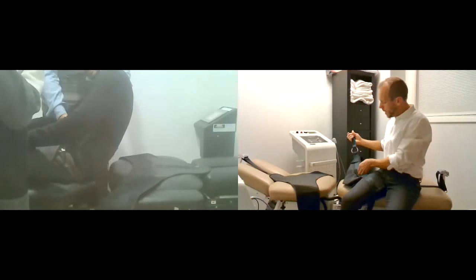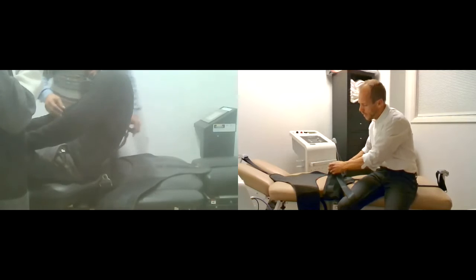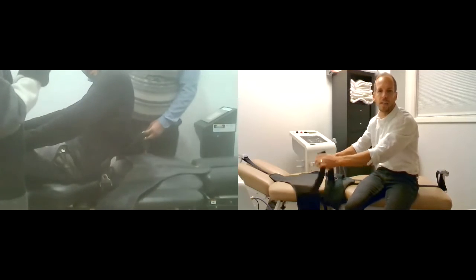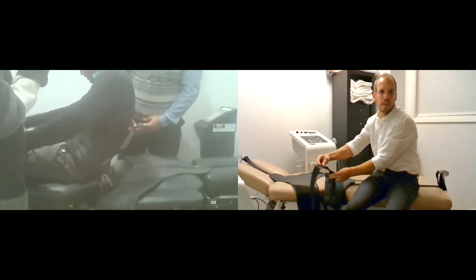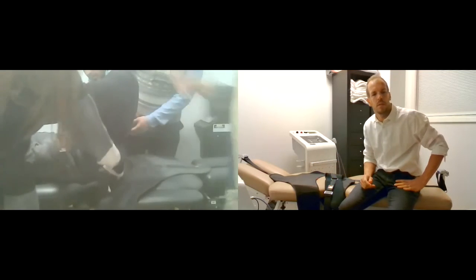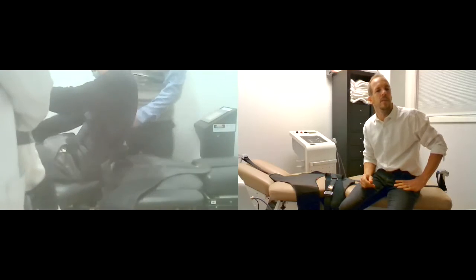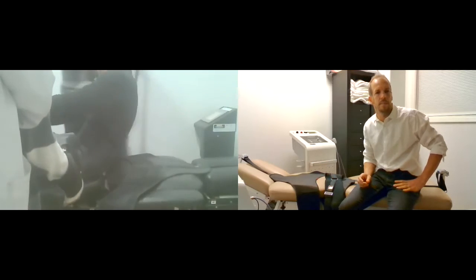Pull it through the back here. Run it through so that your extra fabric is on the side of the computer. Pull it all the way through, and then turn it around and run it through the other way.